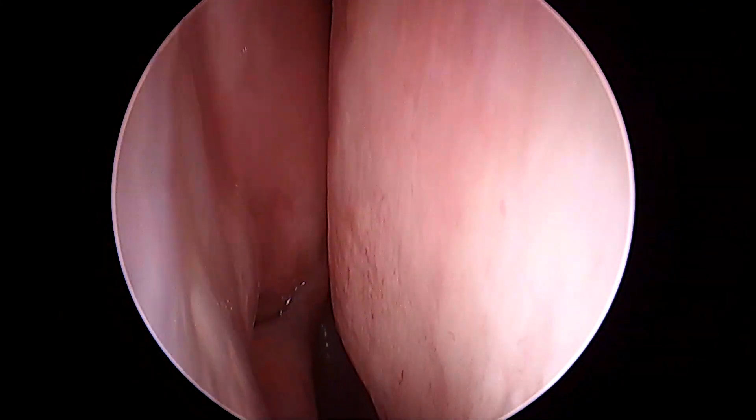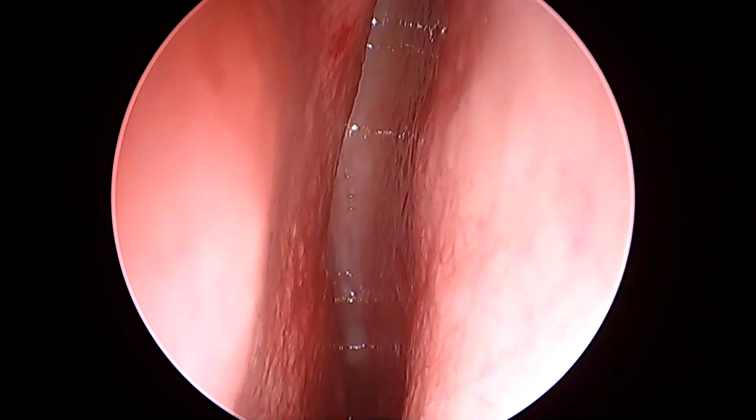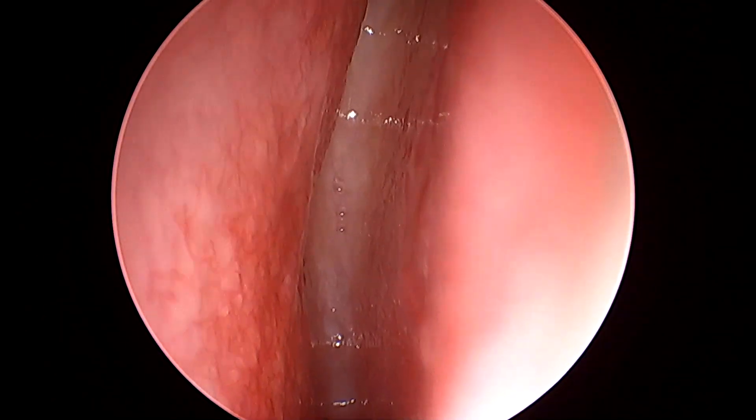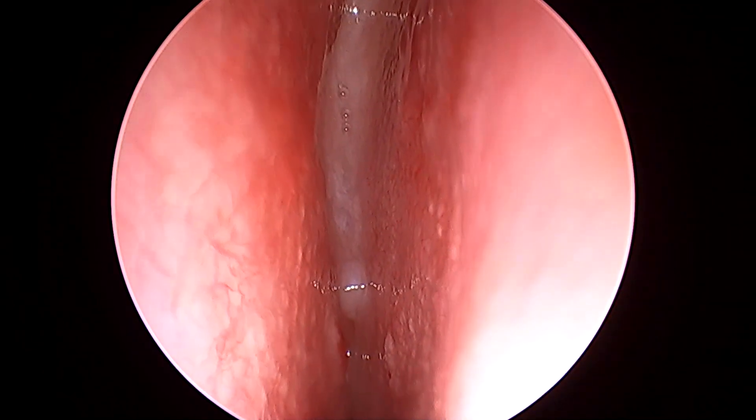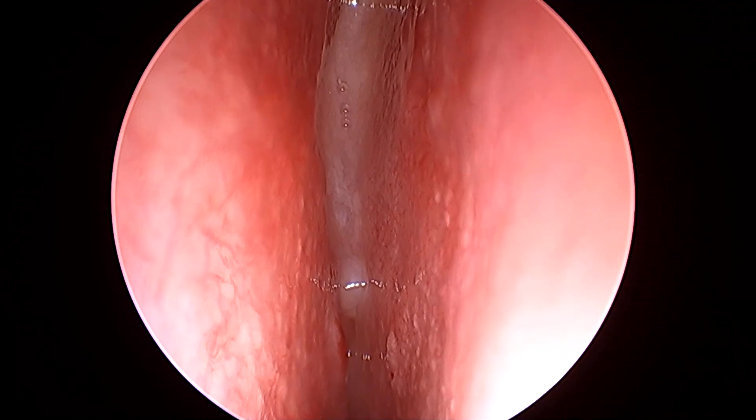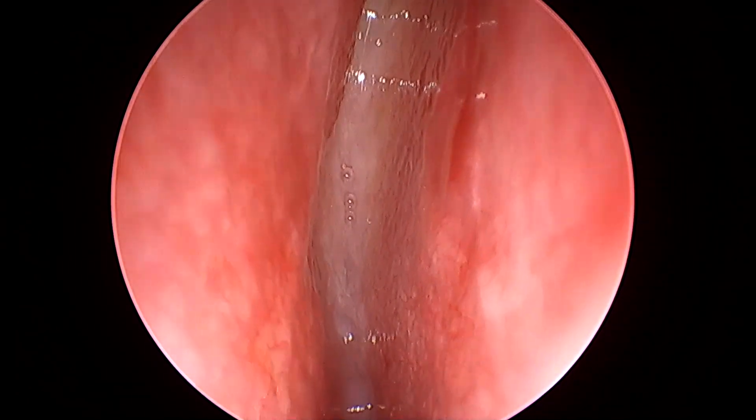I'm going to use a 70 degree endoscope now. As we go behind the cribriform plate you can see the yellowish-white mucosa — that's the olfactory mucosa. You can see that pseudomeningocele right there.